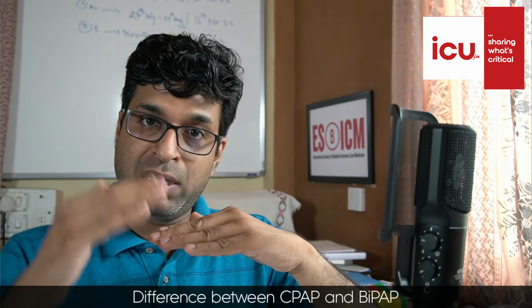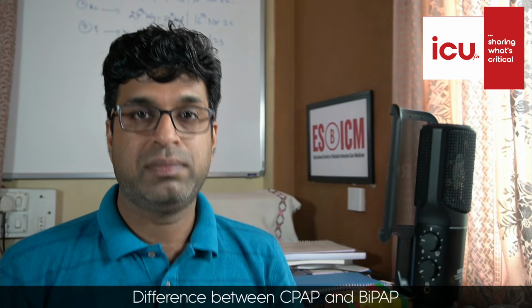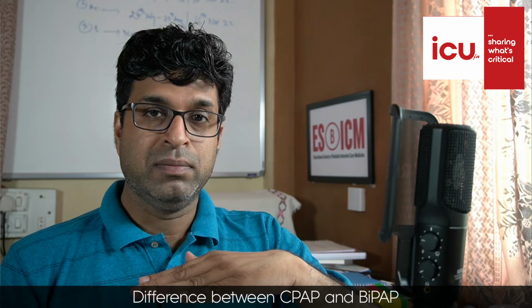What this is doing is preventing the alveoli from collapsing during expiration. So basically it is a positive pressure at the end of inspiration and expiration both, so that your alveoli don't collapse. Suppose I breathe like this and my alveoli collapse, but because of hypoxemia we want there to be a minimum pressure below which we don't exhale and the alveoli don't collapse. So what will my CPAP do? It will inflate the lung like this, or it will prevent the lung from deflating below this point, and this pressure will remain both in the inspiratory cycle and the expiratory cycle. So this is a continuous pressure.